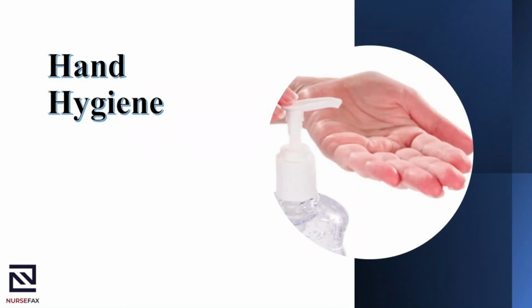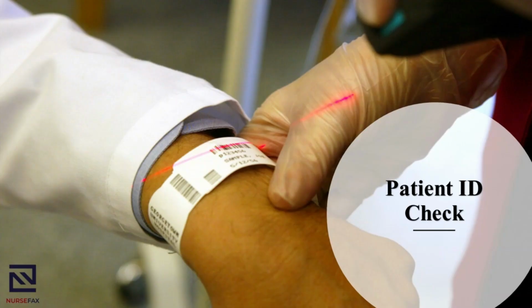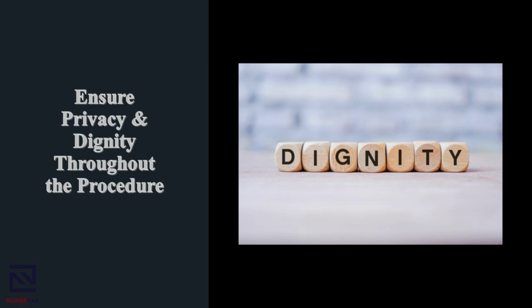Hand hygiene. Introducing yourself to the patient by saying your name and adding that you are going to look after them today. Confirm the patient's identity. Ask for their name, date of birth and hospital number, but you can also confirm this by checking against their wristband. It is mandatory to know about the patient's allergy in the introduction phase. Explain the procedure to the patient and gain consent. Ensure privacy and dignity throughout the procedure.